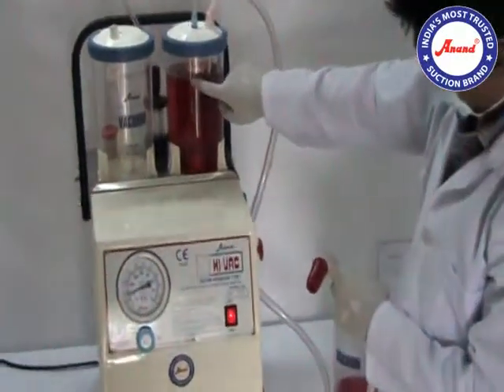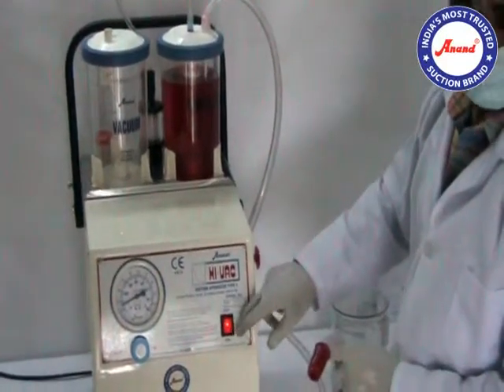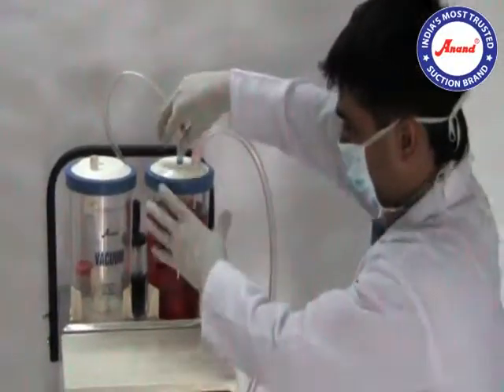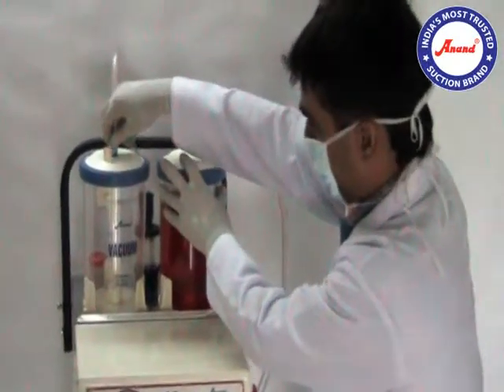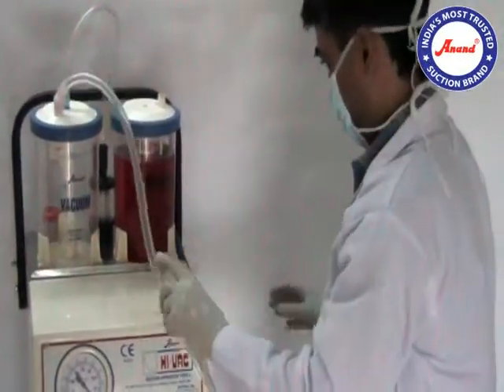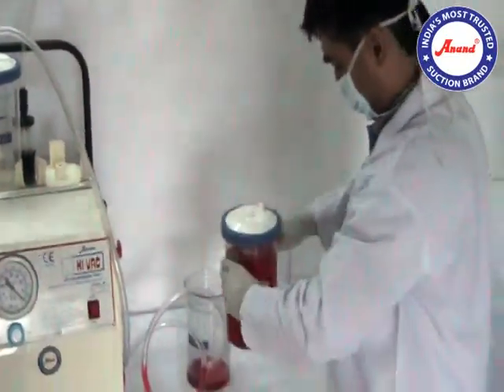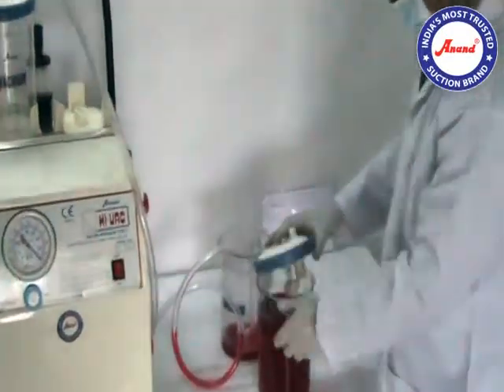Ensure that the jar is not filled more than three-fourths. Twist the jar and pull upwards. Clean the used jar and let the mechanical overflow cutoff device run thoroughly under running water.